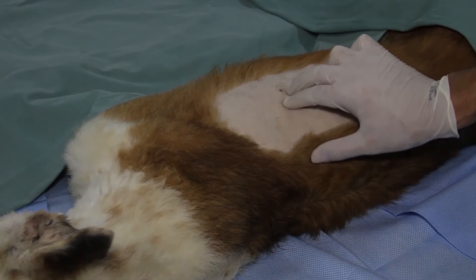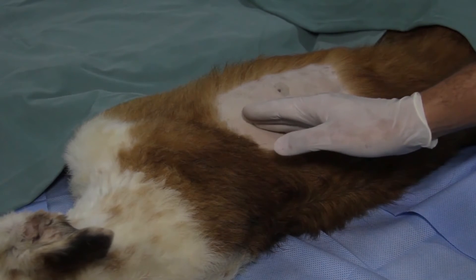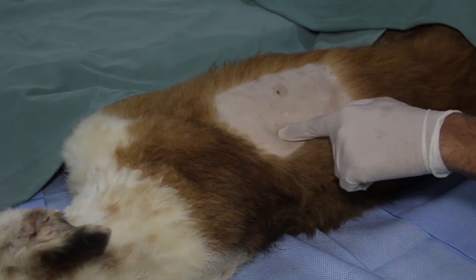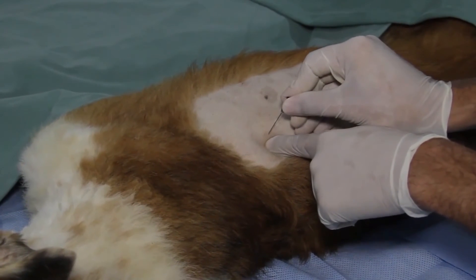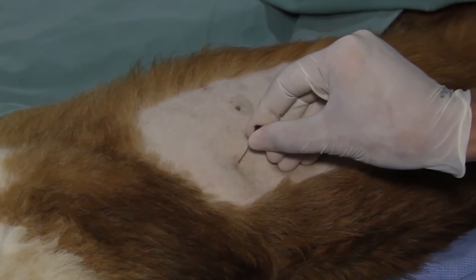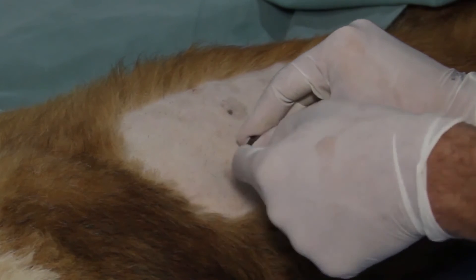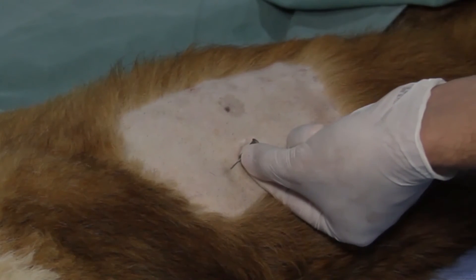The intercostal nerve is located caudally to its associated rib. Using an aseptic technique, a 24 gauge or spinal needle is inserted through the skin directed towards the caudal border of the rib. The needle is then walked off the bone in a caudal direction and redirected towards the medial aspect of the rib. Aspiration prior to injection must be made to avoid an intravascular or intrapleural injection.